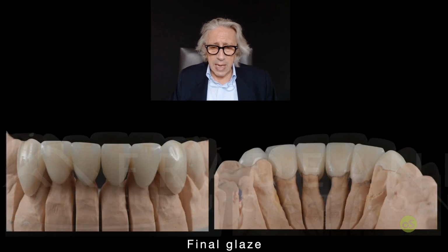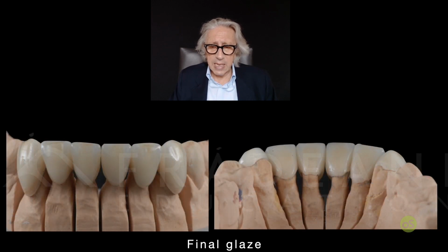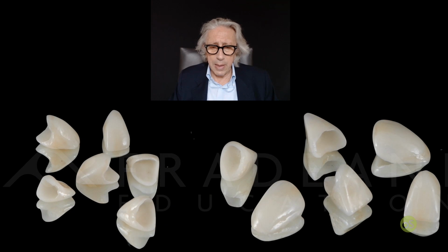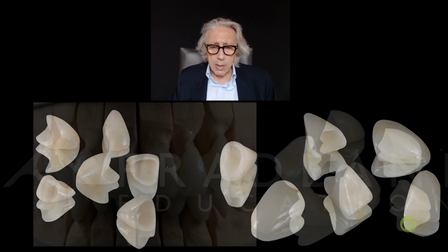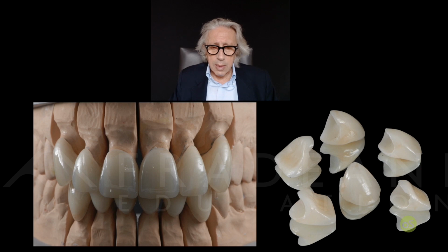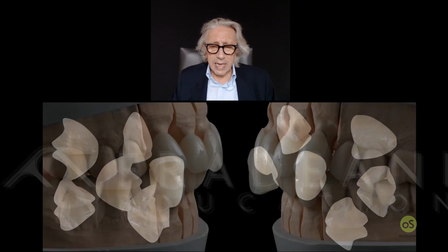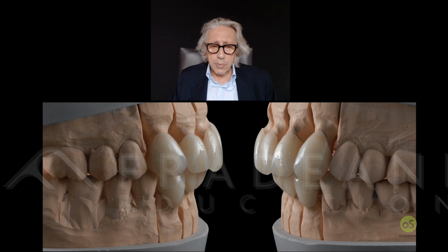Upper teeth, final glaze, lower teeth, final glaze either. Final glaze on the upper, final glaze on the lower, lingual and palatal part. So, upper, lowers, anteriors, in place. All the pressing technique was used, and now, once you set the posterior, now you set the anteriors.